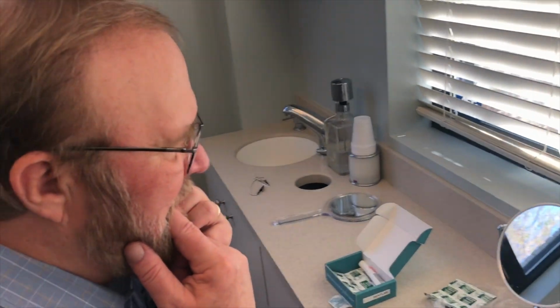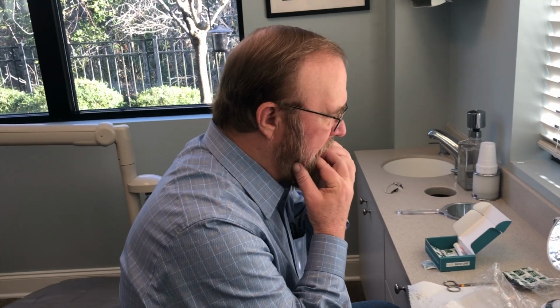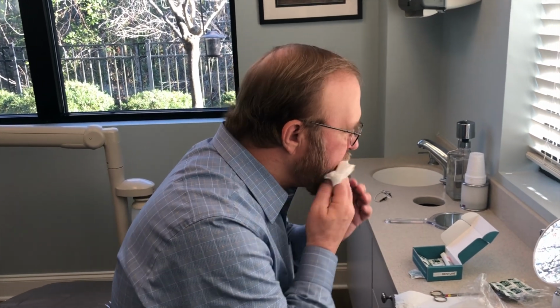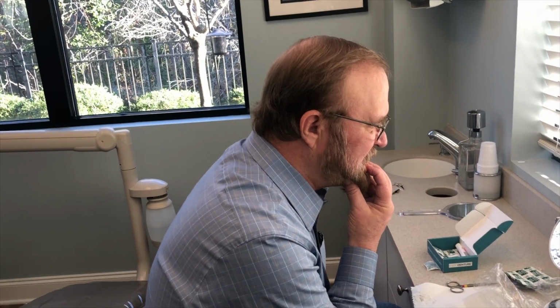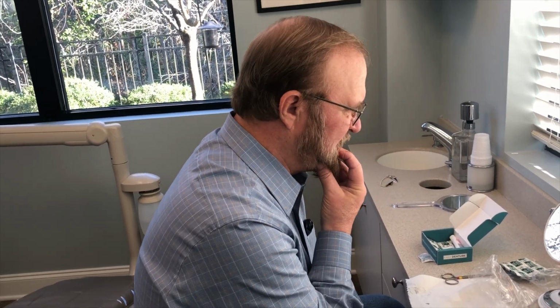Nice, okay. Is the bite lining up? Does it feel like it's even on both sides? Because if it's not, you can just put it back in hot water and do it again. I bet it's open on this side over here, but if it feels stable to you, then you could keep it there. We could reheat it and do it again. It's really up to you.